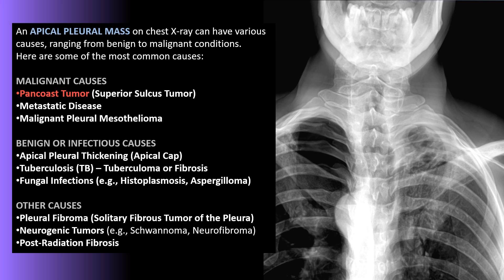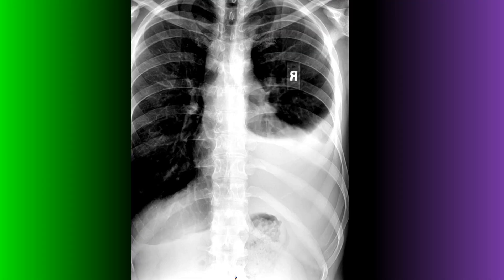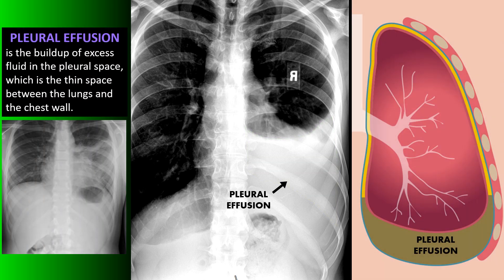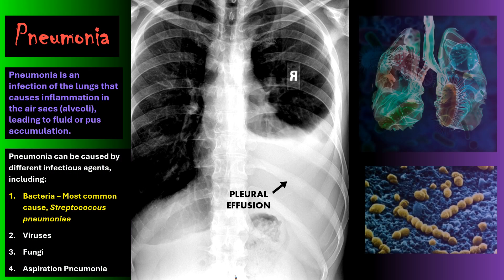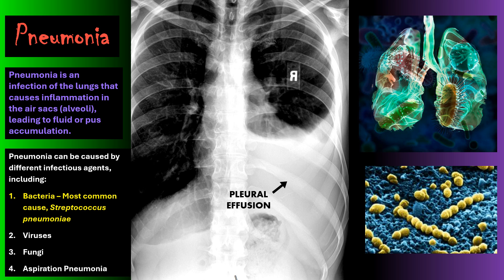On this frontal view of the thoracic spine and chest, you'll notice in the right middle lung field there is a large area of increased density representing a consolidation or pleural effusion. A pleural effusion is a buildup of excess fluid in the pleural space — the thin space between the lungs and the chest wall. One of the most common causes is pneumonia, an infection of the lungs causing inflammation of the air sacs leading to fluid or pus accumulation. The most common cause is bacterial, from the Streptococcus pneumoniae strain.